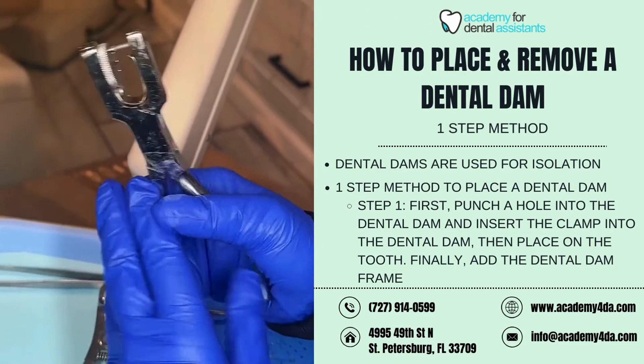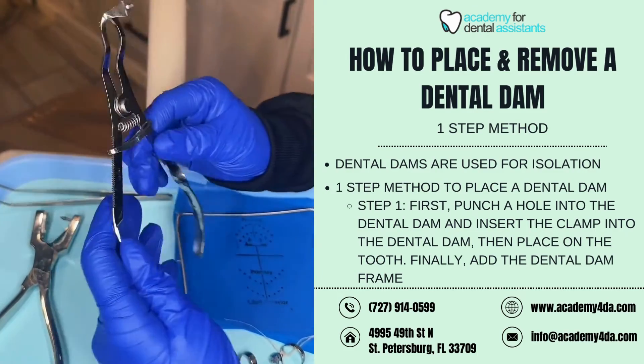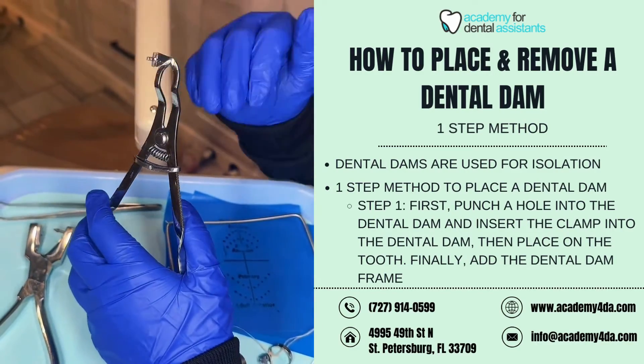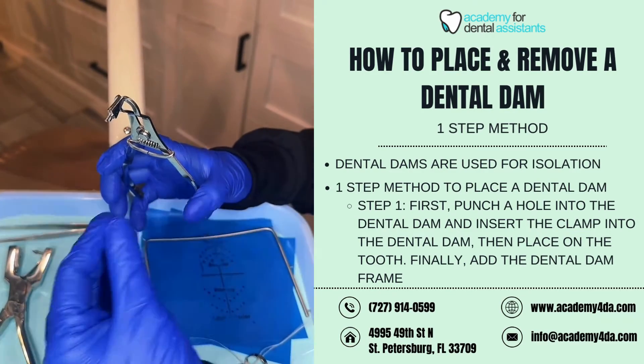This here is our hole punch, which is going to be used to help punch a hole in our dental dam to fit around the tooth. This here is our dental dam forcep. Our dental dam forceps have prongs or projections, also known as beaks, that protrude out of it.